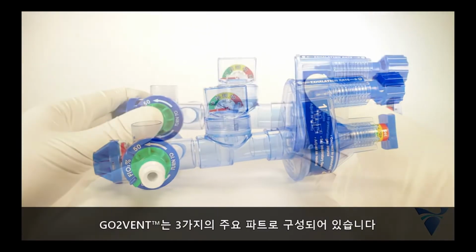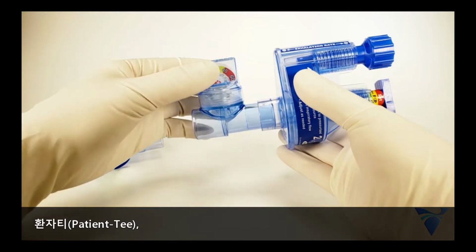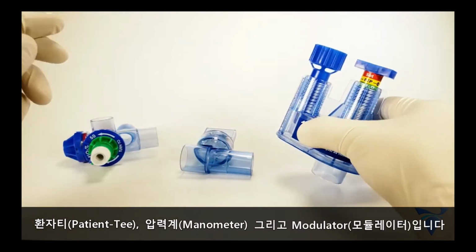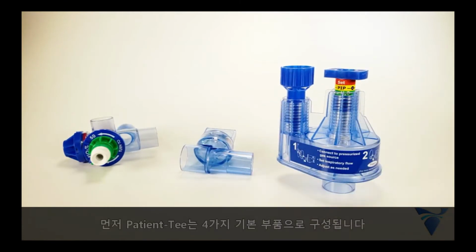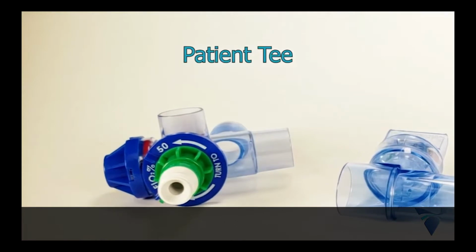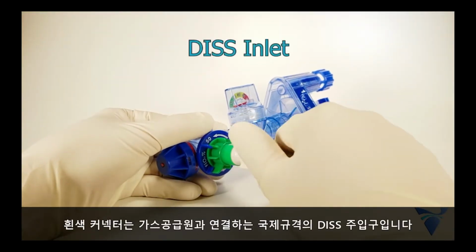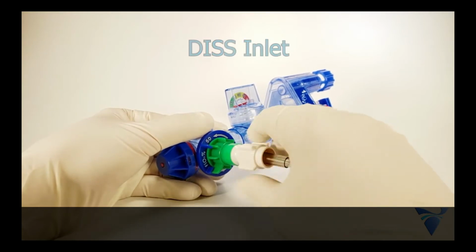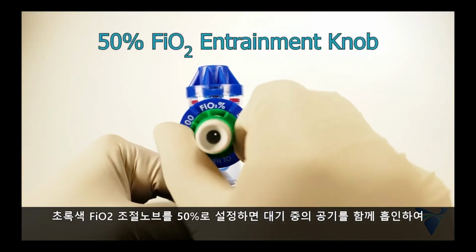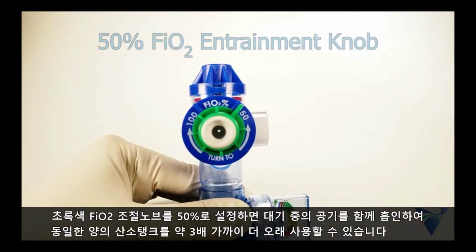The GO2VENT consists of three major parts: the patient T, the VORTRAN manometer, and the modulator. First is the patient T portion of the device, which consists of four basic components. It features a standard DISS inlet for connecting to a gas source. The GO2VENT's air entrainment knob allows any oxygen tank to last approximately 3 times longer when set to 50% FiO2.